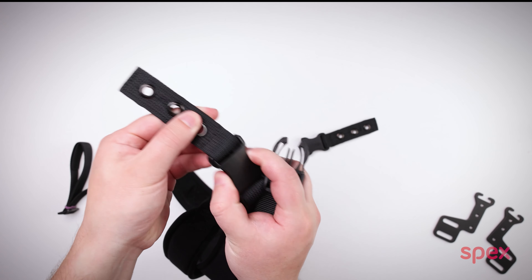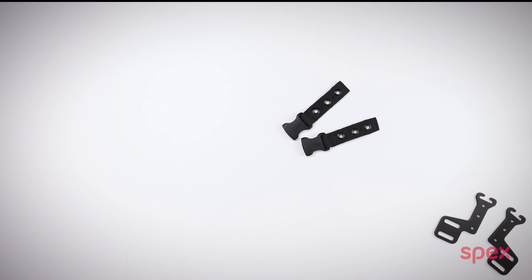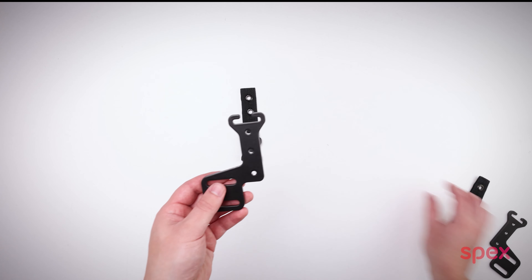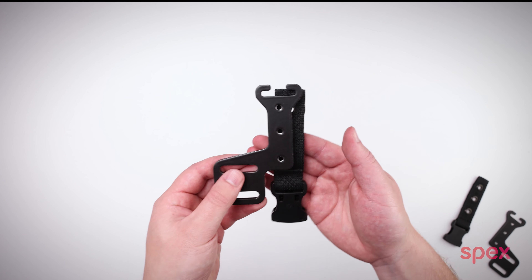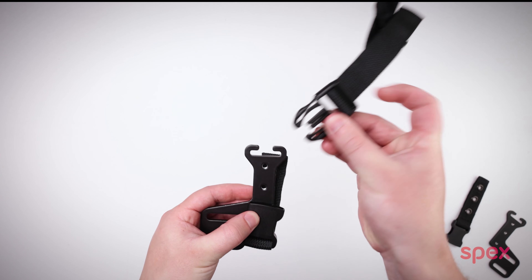Firstly, remove the short top attachment straps from the harness as these will be mounted to the guides. These are to be installed with the clip facing down, because then it loops underneath and then back up for the strap of the harness to clip into, like so.